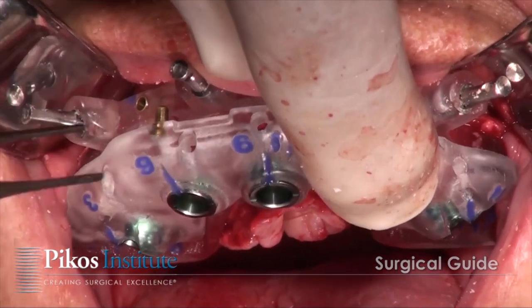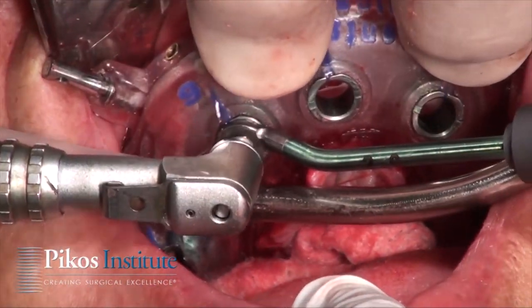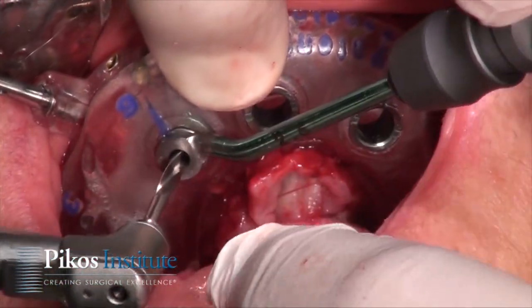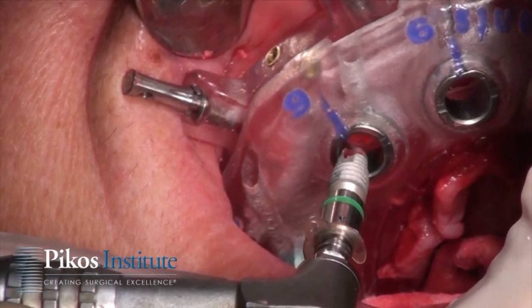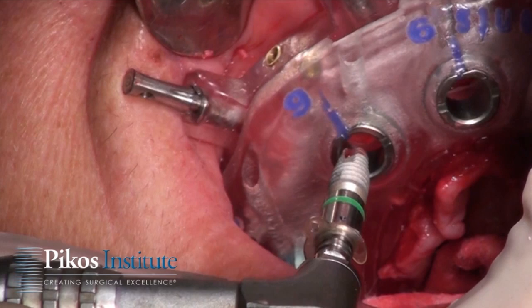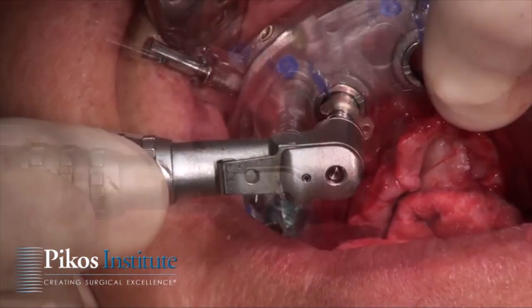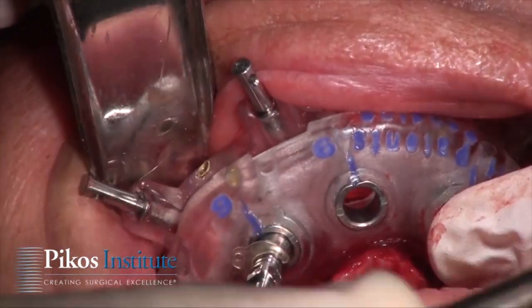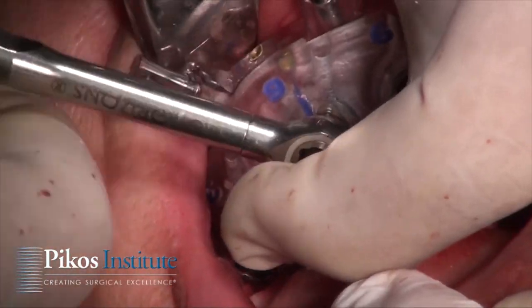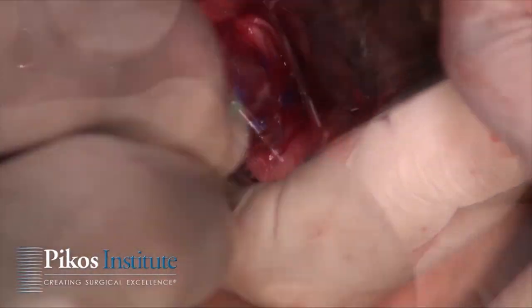So now the surgical guide is pin indexed into the foundation guide. And now we can go about using our appropriate keys for whatever implant system we're working with to fully guide implant placement. Again, predetermined length, diameter, and angulation of the implants. That's all done in advance with our virtual planning, by the way. The entire workup is virtual. And here you're seeing implants being placed in a very specific manner, times five in the maxillary arch in this particular case.